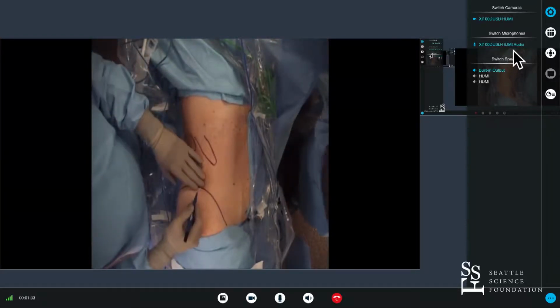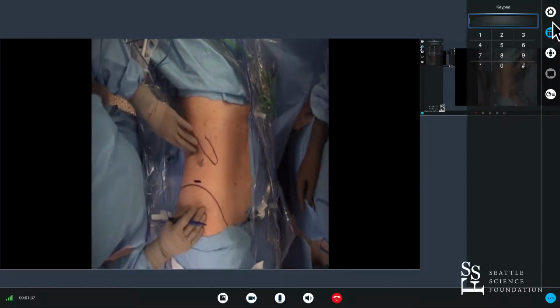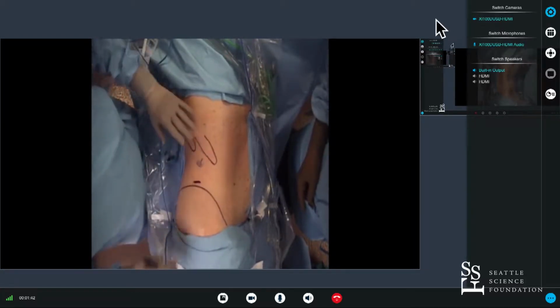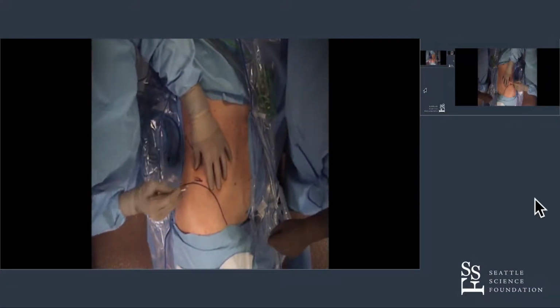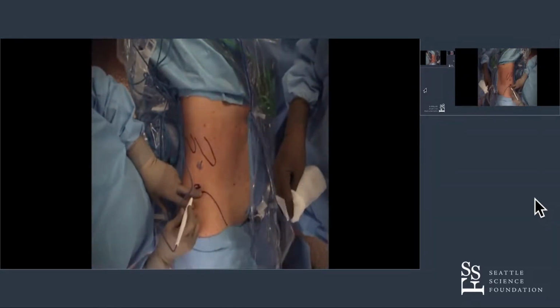What Jim's doing right now is you can see he's marked out the iliac crest. He's making a mark there in the mid-axillary line. And you want to be just above that iliac crest. You really want to feel for it, and you want to go just above it. You can't be right on it, because then your port's going to torque on it, because remember that is the camera arm, and it's going to be kind of flattening out to be able to see the kidney. So you got to go a little bit above that.